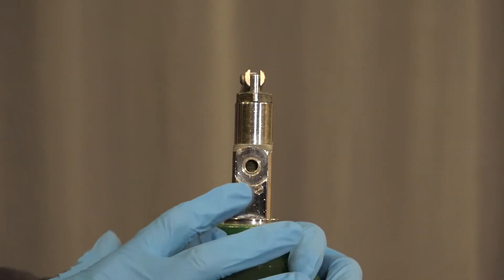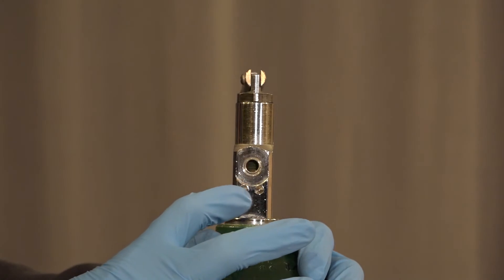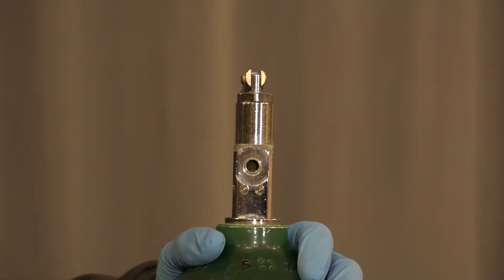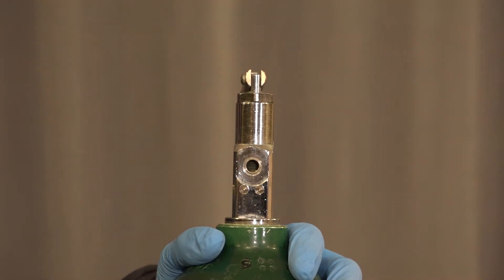As we look at the yoke of the tank, we take a look at the pin index safety system. We see one big hole and two smaller holes. This specific configuration is part of the pin index safety system for an oxygen tank, to make sure that an oxygen regulator will only fit onto an oxygen tank.